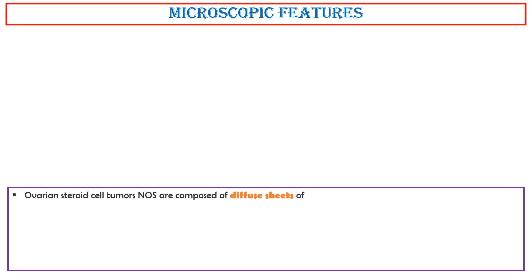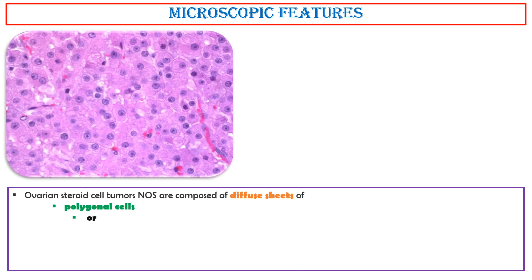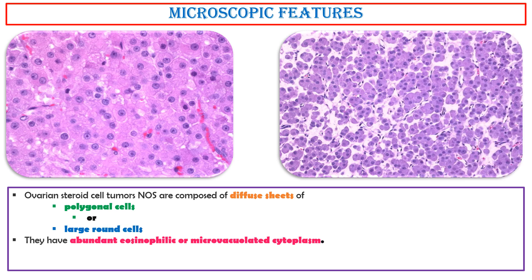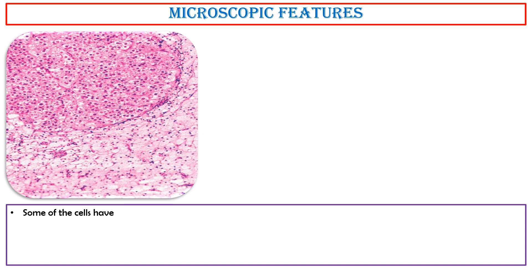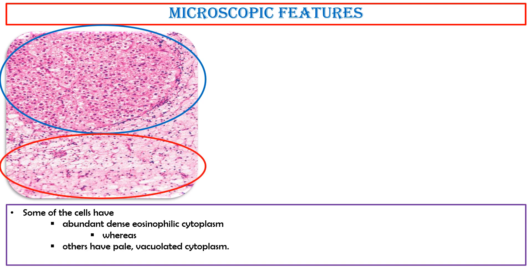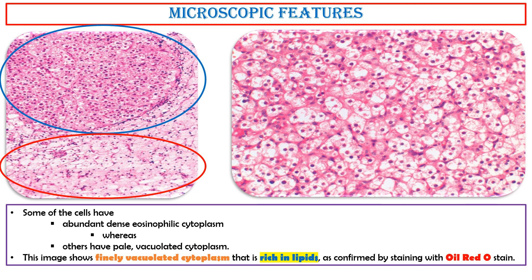Ovarian steroid cell tumors are composed of diffuse sheets of polygonal or large round cells. They have abundant eosinophilic or microvacuolated cytoplasm, distinct cell borders, central nuclei, and prominent nucleoli. Most tumors have no cytologic atypia and at most 2 mitoses per 10 high-power fields. Some cells have abundant dense eosinophilic cytoplasm, whereas others have pale vacuolated cytoplasm. This image shows finely vacuolated cytoplasm that is rich in lipids, as confirmed by staining with oil red O stain.